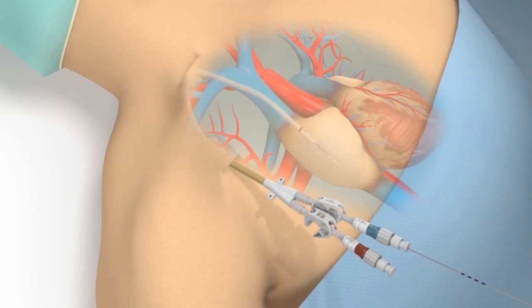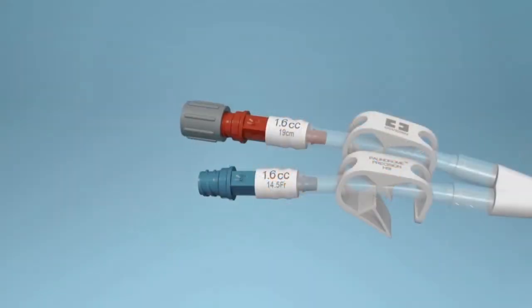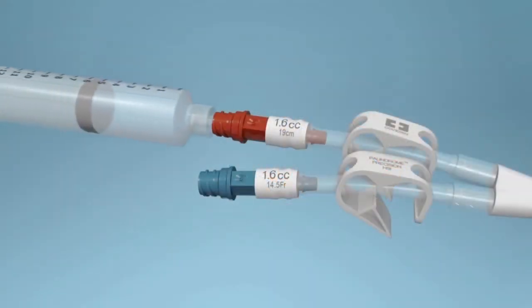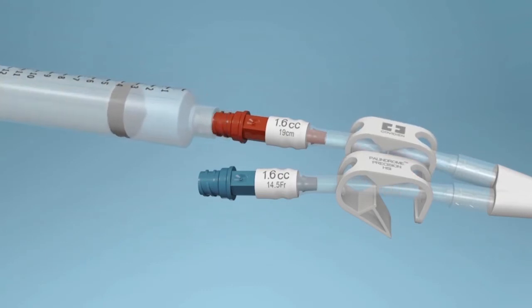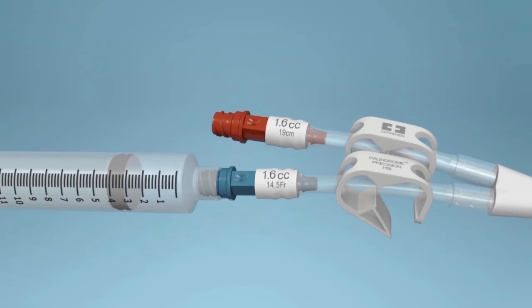Holding the catheter in place, gently remove the guide wire and discard. It is important that the guide wire is always removed first before removing either stylet. Next, immediately unlock, remove, and discard each of the 2 Tal-Vena-Trac over-the-wire insertion stylets, being sure to clamp the catheter extensions. Flush the catheter with sterile heparinized saline and clamp the extensions immediately to decrease the risk of air embolus. Keep the catheter clamped at all times while not attached to a syringe to prevent air from entering the catheter.